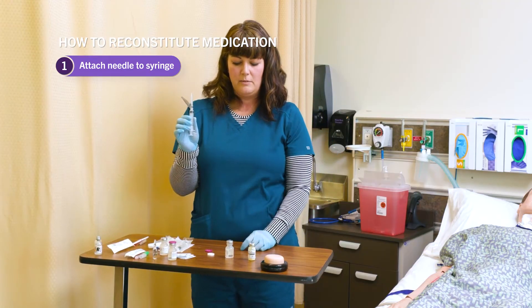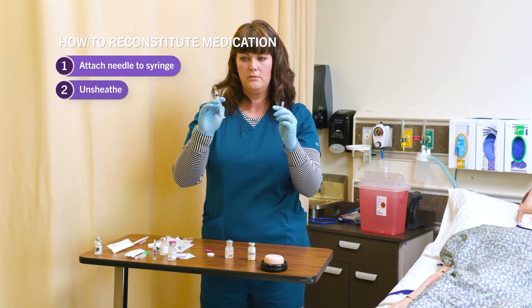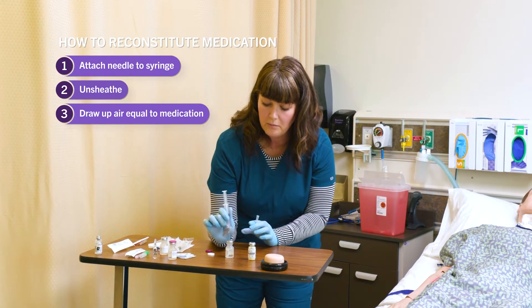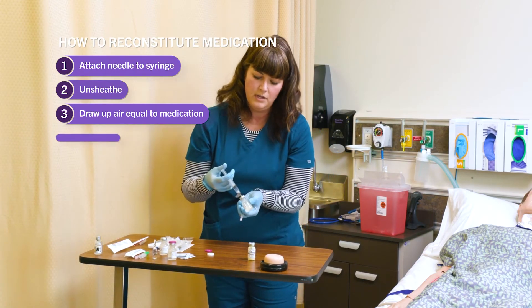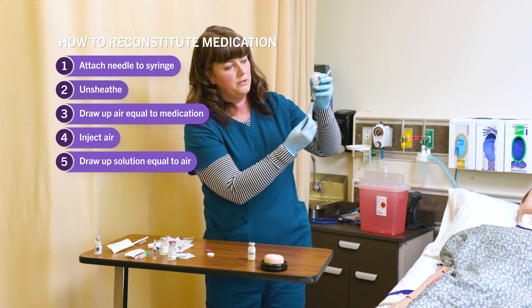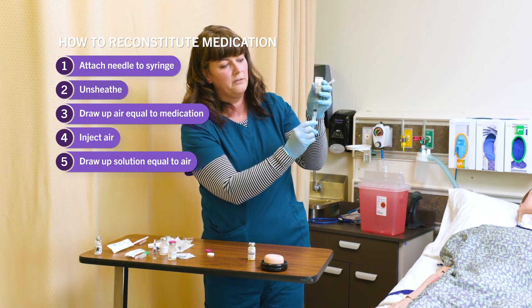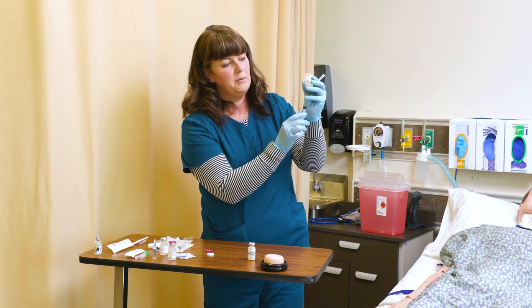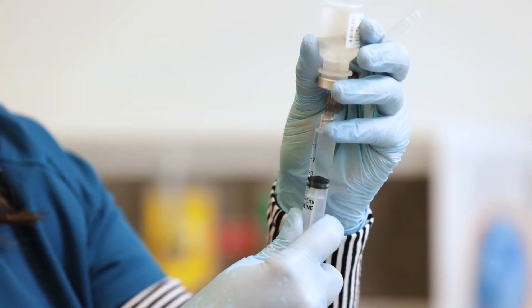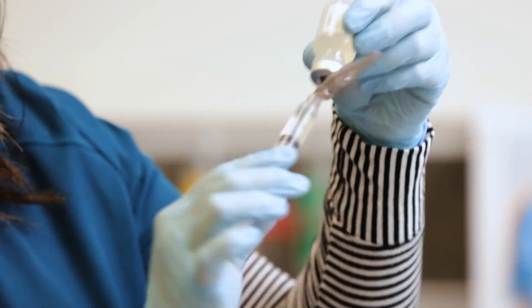I have my liquid medication that I'm going to draw three milliliters of and inject into my powder to reconstitute. First I unsheathe, then I draw up three milliliters of air — you can also do that before you unsheathe your needle. I inject my air and draw up three milliliters of solution. If you do this slowly, you don't get as many bubbles. If you pull down really fast, more bubbles appear, so just be patient when drawing up solution. If you get bubbles, you can flick them out. Three milliliters.